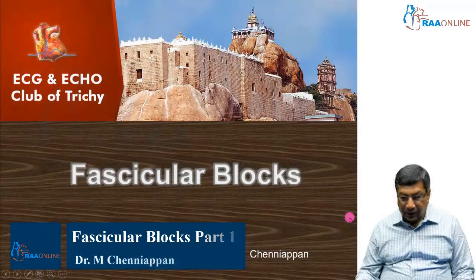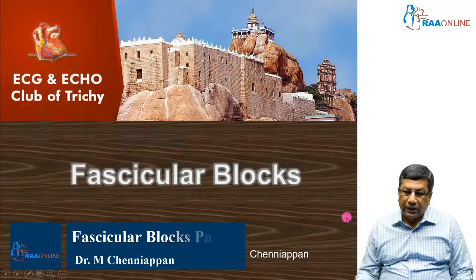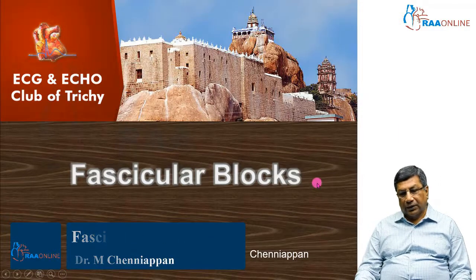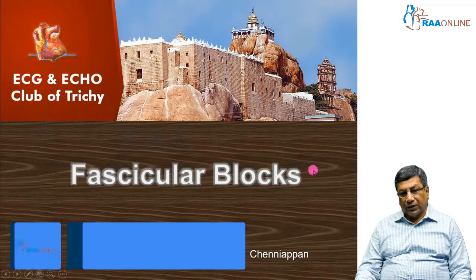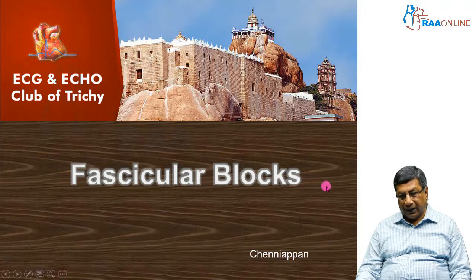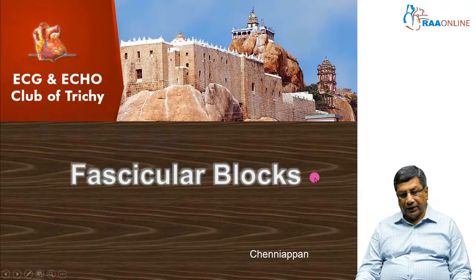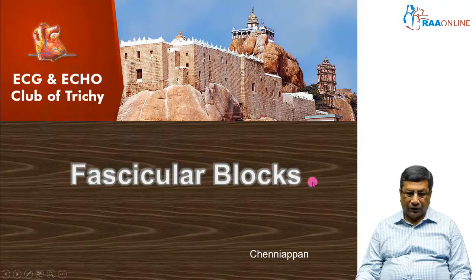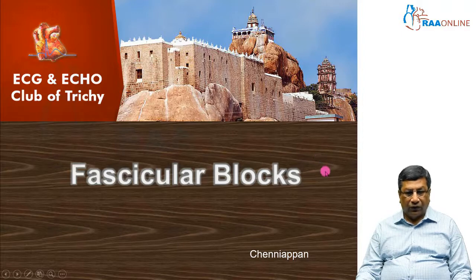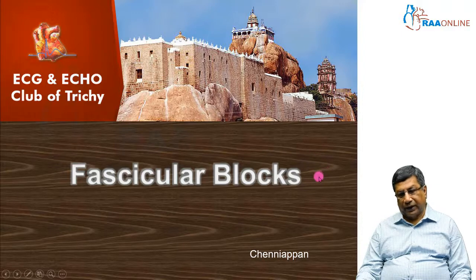After bundle branch block, we are going to see the fascicular blocks. The fascicular blocks — as you know, the fascicles are there only for the left bundle. The two fascicles are the left anterior fascicle and left posterior fascicle. It is possible to diagnose the individual fascicular blocks from the electrocardiogram.